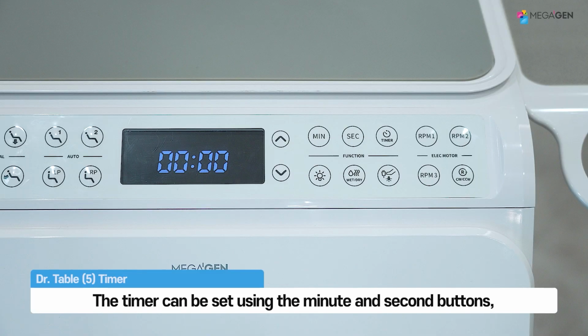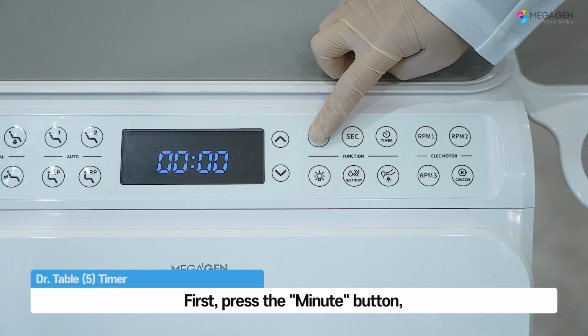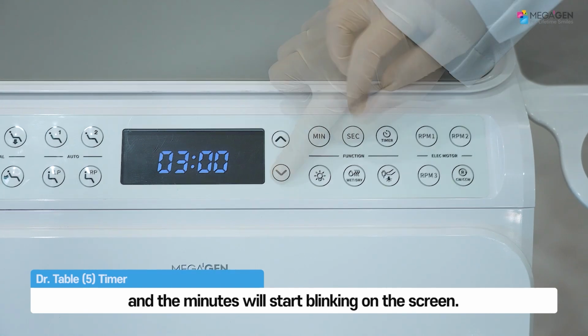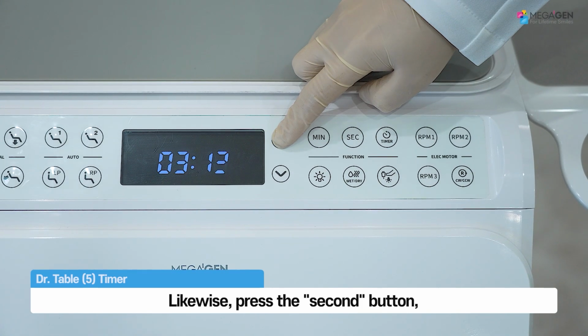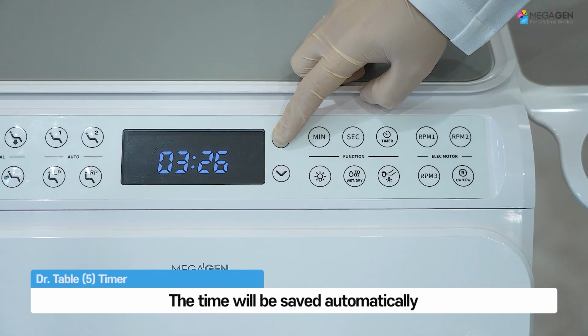The timer can be set using the minute and second buttons, which is useful for taking impressions. First, press the minute button, and the minutes will start blinking on the screen. Use the up and down arrows to set the desired time. Likewise, press the second button, and use the arrows to set the time in seconds. The time will be saved automatically.